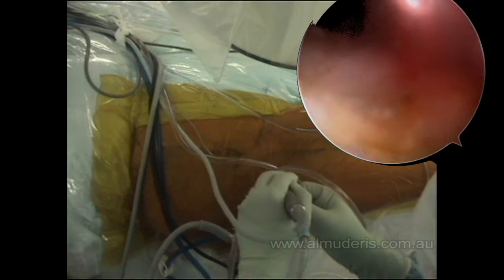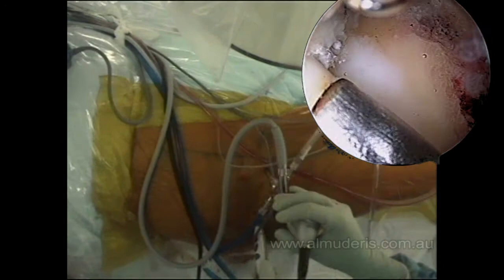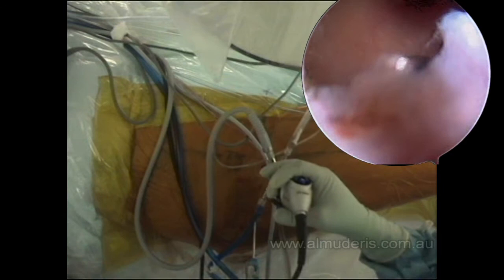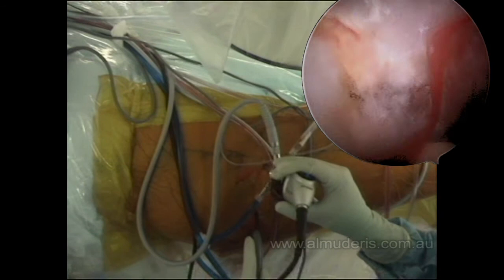Since this burr can be extremely aggressive, I swap the portals. Now I am looking at the pathology from the top, trying to go to the lateral aspect — this is the head-neck junction and the bump is just down here. I am using the shaver now to clear the tissue around the bump. This is exactly where the bump is — this is the head-neck junction. This area is part of the head, this area is the neck, and the bump is at the head-neck junction.